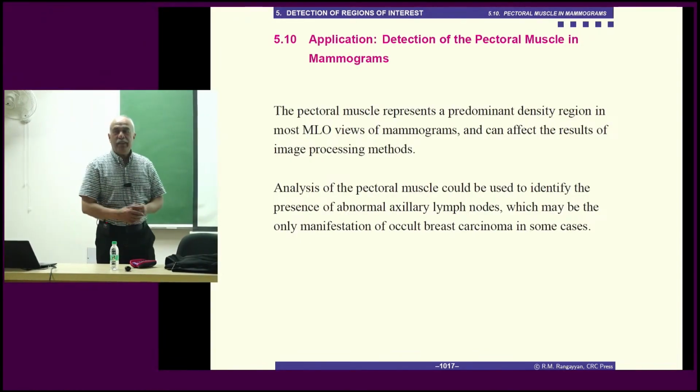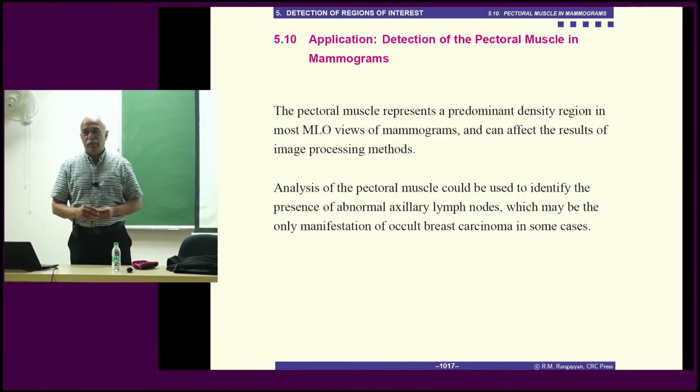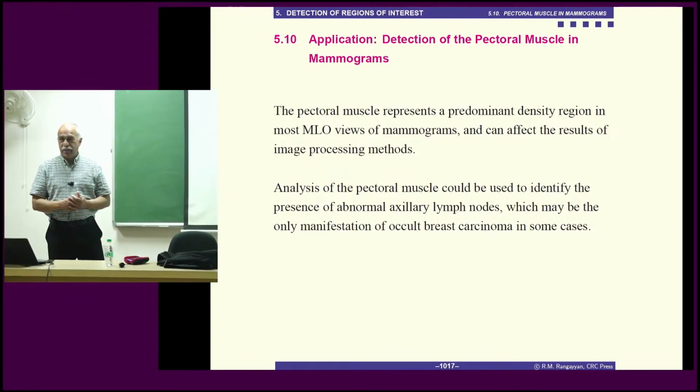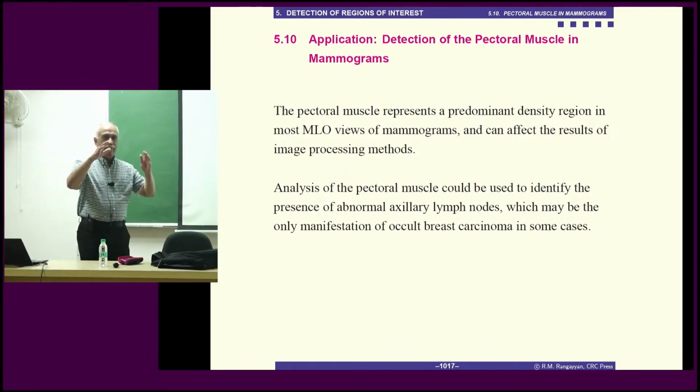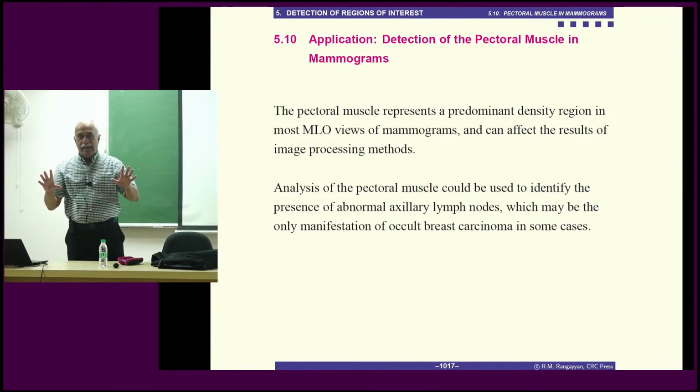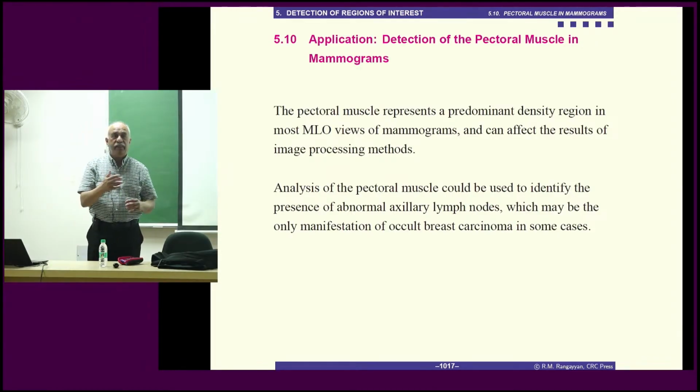Let's look at another application in the processing of mammograms. First we saw detection of the breast boundary. When you have a mammogram, there could be other parts outside the breast that you want to get rid of, and you don't want those pixel values to affect further analysis.